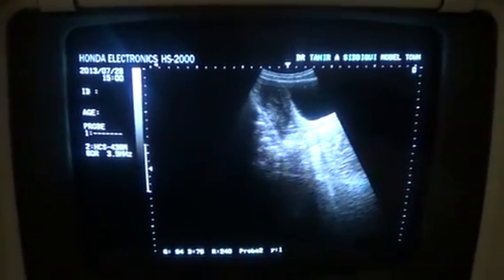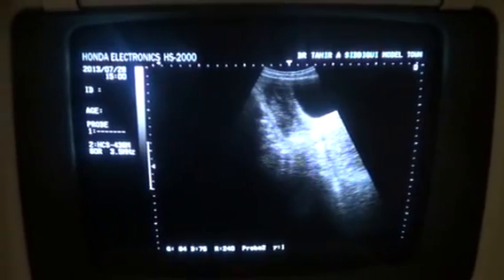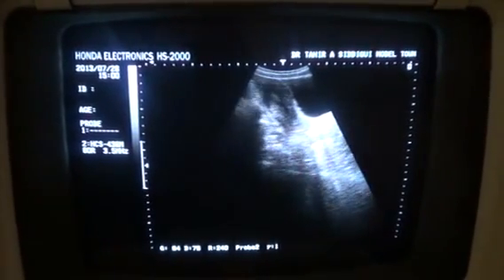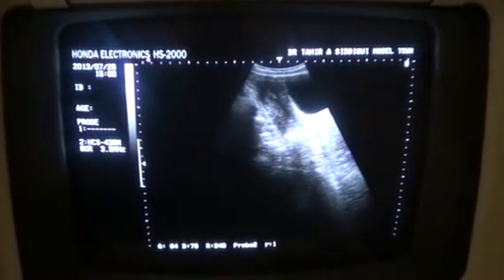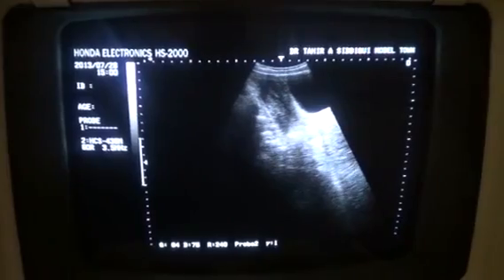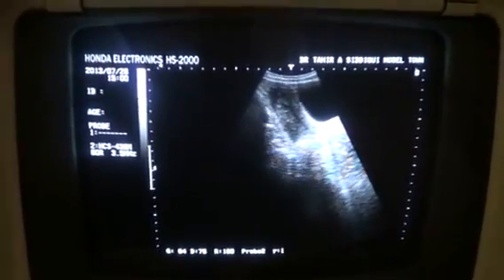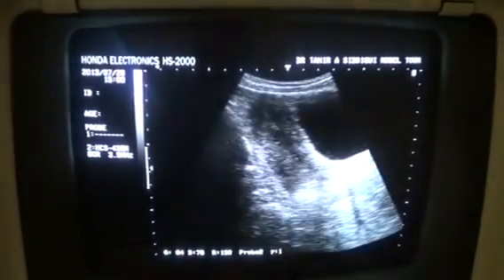This is an ultrasound study of a patient complaining of severe pain in the region of the right hypochondria, radiating to the epigastric region for the last few days.